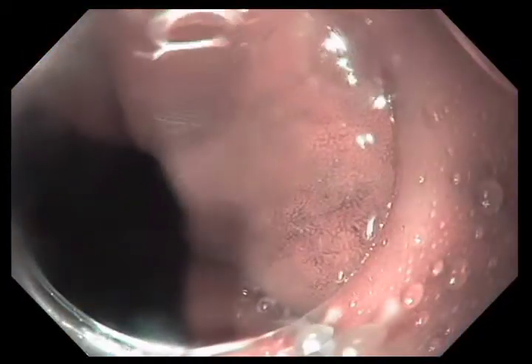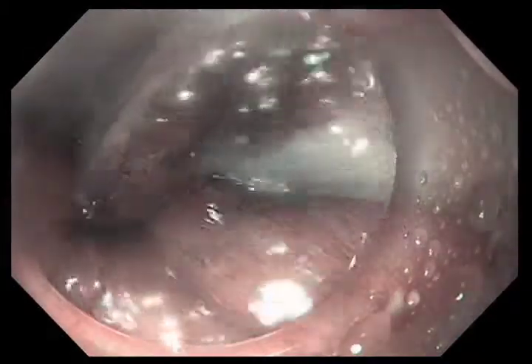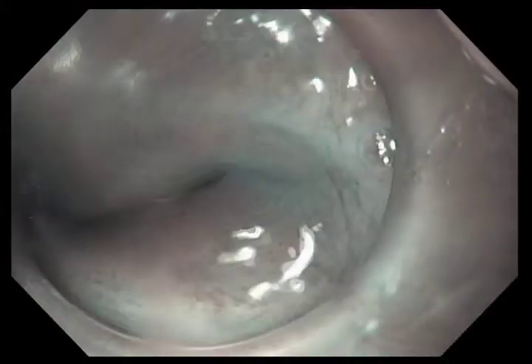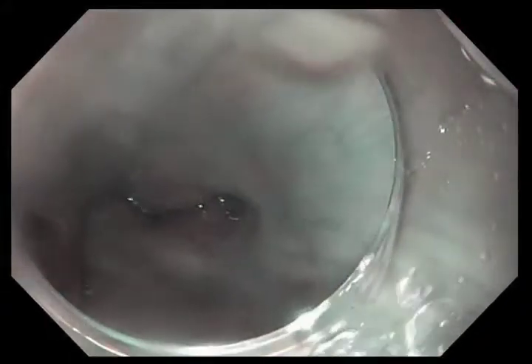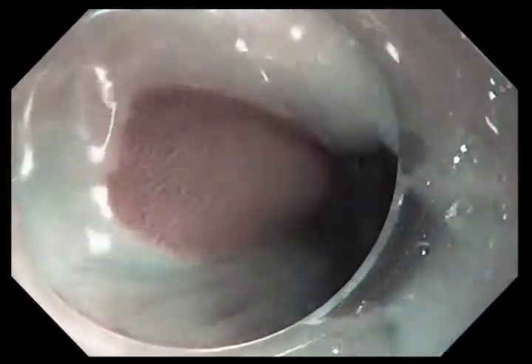We're now switching to what's called NBI, narrowband imaging. This is a way of filtering the light so the blue light is the primary source of light. This highlights both the mucosal vessels as well as a mucosal pattern. You can see that it's easy to distinguish the white squamous epithelium from the darker mucosal-patterned Barrett's epithelium in the center of the image. NBI is used as a better way of distinguishing squamous epithelium from Barrett's epithelium.